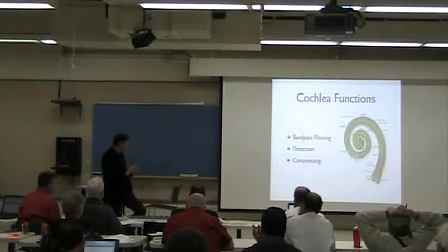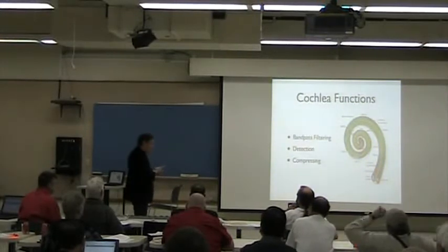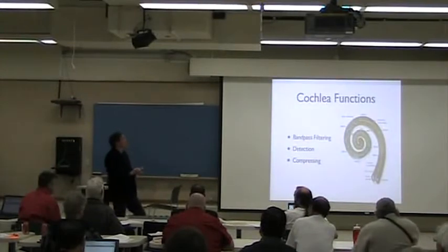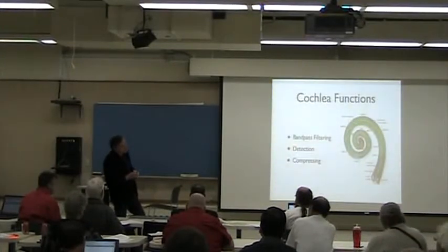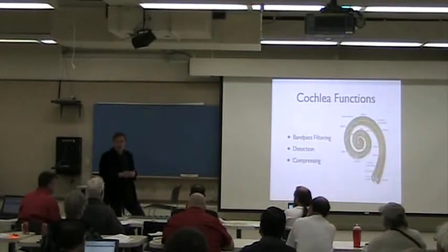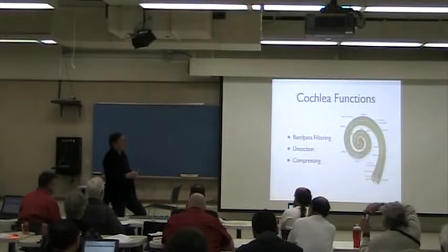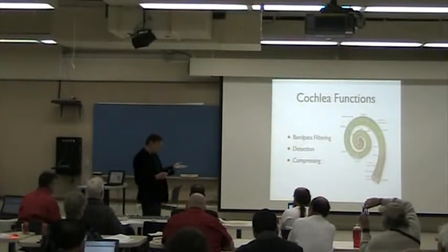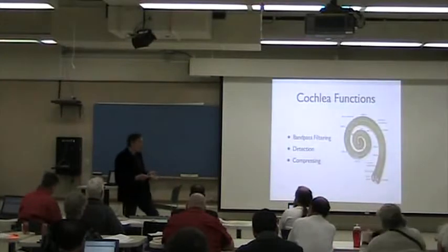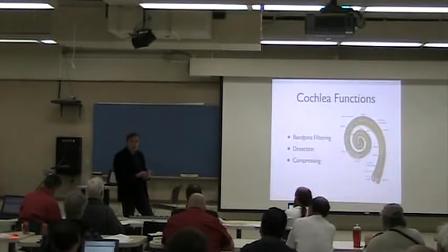The thing is that biologically or physically we cannot hear more than a 60 or 90 dB range, and still a book says that the dynamic range of sound people can recognize is 140 dB. How does this happen?